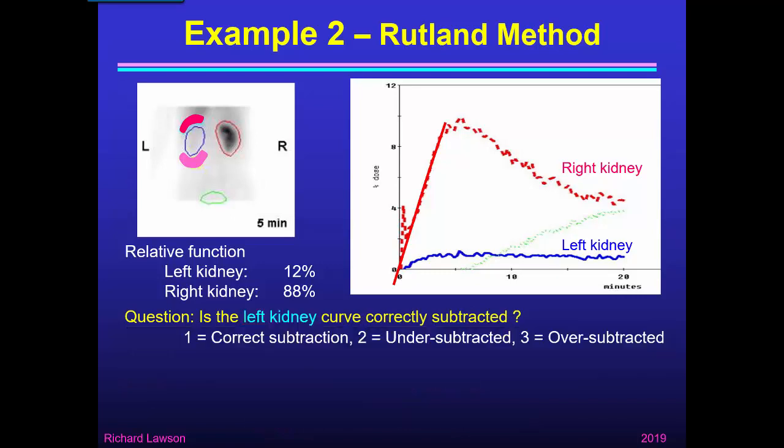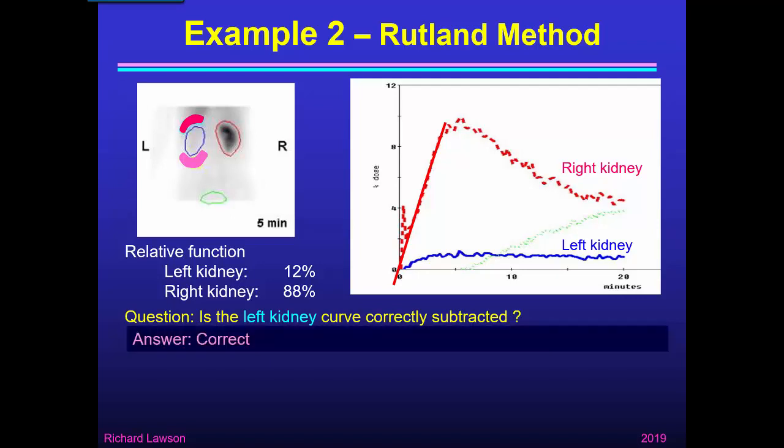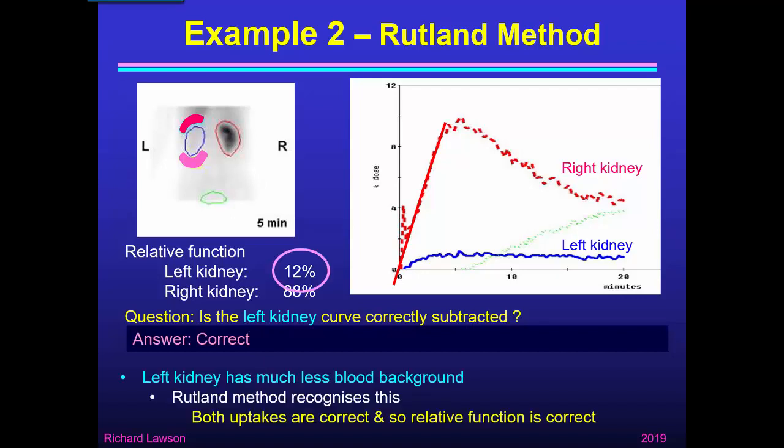What about the left kidney? I think it's quite clear that this is now correct — it does start from zero. The left kidney had much less blood background than the right kidney, but the Rutland method deals with that quite well and takes less blood background from the left kidney than it did from the right. So both uptakes are correct and relative function is correct. The answer of 12% for the left kidney is the best estimate of the relative function for this patient — we couldn't believe the 0% or 3% from the other methods, but here we have correct subtraction for both kidneys.